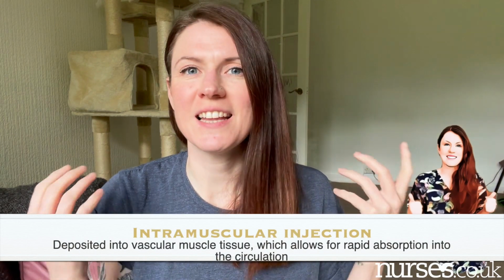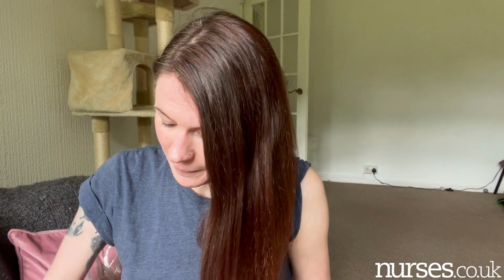So next we have intramuscular injections, or IM injections, and this is literally, as it says on the tin, into the muscle. With this one, when you draw up with the green needle, depending how big or small the arm is, like me, I would use a blue needle. That would get into the muscle quite fine, because look how size that needle is, it's going to go into my muscle easily. So depending on the size of the person, choose your needle size. Then draw up, change your needle over, put the blue one on, and this time you're going directly in at a 90-degree angle straight into the muscle.